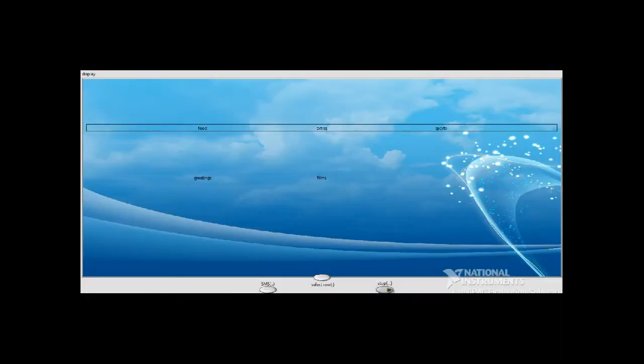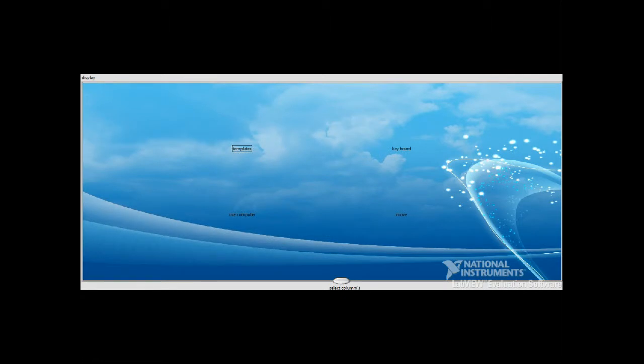This is how the main user menu looks like. The menu consists of options such as templates, keyboard, computer usage, and more. Template selection: in this mode, a row is toggled and then the column so that a particular option is chosen. This is an example of auto toggling, where the row or column toggling would stop only on a blink. A demonstration.